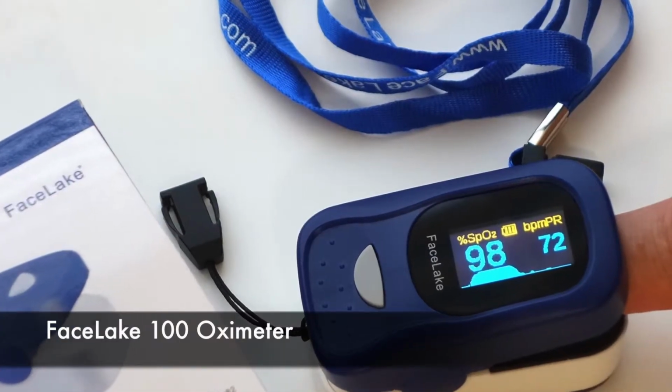I'm going to talk to you today about the FL100 oximeter. You can get it on Amazon, and right now we're trialing it with a group of patients. I just want to tell you the purpose and why we like using this. First of all, adults who have COPD use this. It has not been trialed that much with asthmatics at home, but it's been done multiple times in the office.